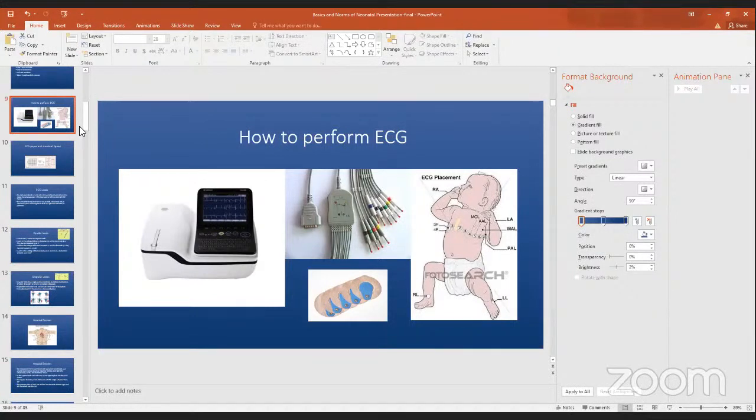No, actually, if we don't know the rhythm, we cannot get the exact heart rate if the rhythm is not normal. That was my comment number one. Number two, I want to comment on Dr. Junaid's question about the value of ECG during newborn resuscitation. Even in the latest NRP, it is very difficult, even in very developed countries; they have not prioritized the EKG during resuscitation.